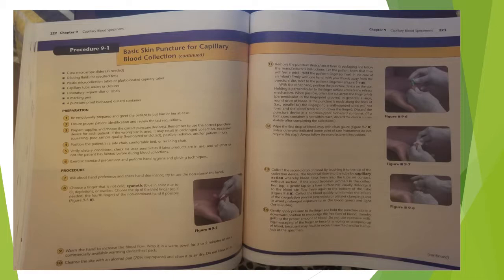Preparation: be emotionally prepared and greet the patient to put him or her at ease. Ensure proper patient identification and review the test requisitions. Prepare supplies and choose the correct puncture devices. Remember to use the correct puncture device for each patient. If the wrong size is used, it may result in prolonged collection, excessive squeezing, poor sample quality, hemolyzed or clotted specimens, possible redraws, and/or patient injury.